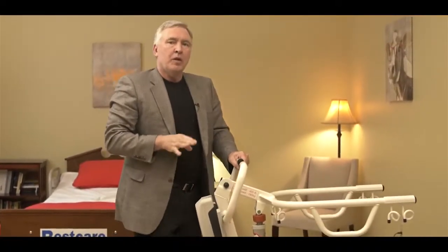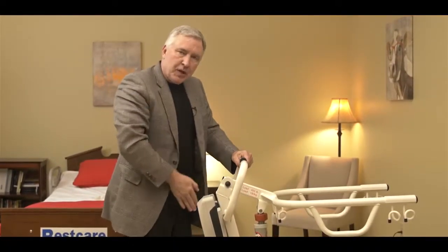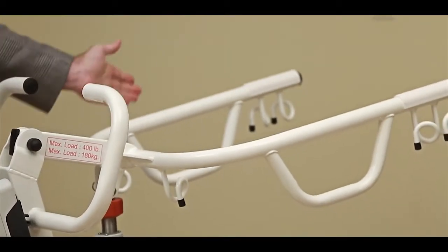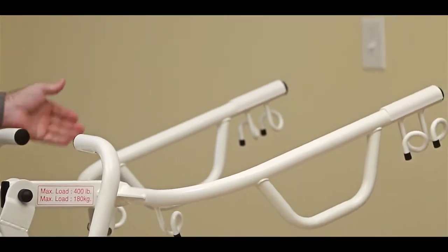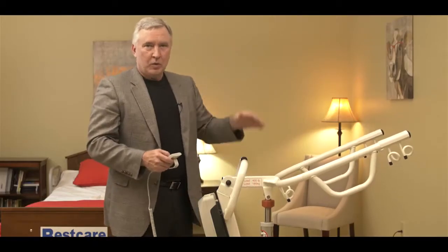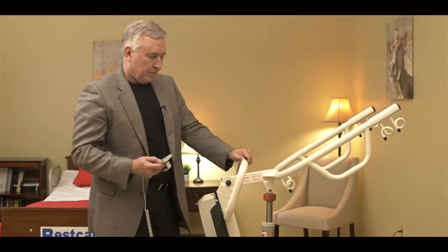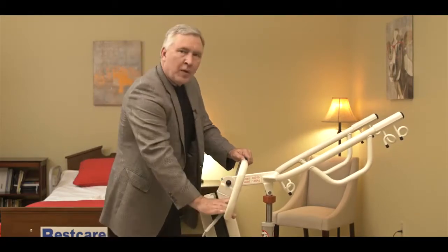This lift operates quite differently than the full body lift because it's designed to stand a person up. When we raise the lift by pushing the button on the remote, you can see that it moves in an arc to get the person into a standing position. That's what's going to happen when we make the transfer with a patient. Now that you understand how to operate the lift, let's go ahead and show you how to lift a patient.